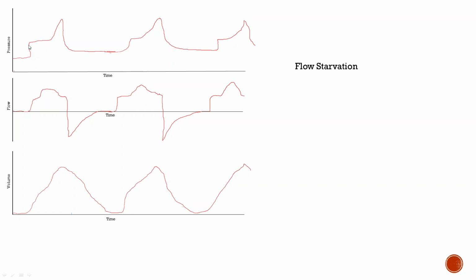So what you see here in the pressure cycle, what Gargi pointed out, it looks weird, looks like they're taking two breaths, is that actually they're sucking in here, so this is showing a more negative pressure than you're expecting. So you have this dipped out effect. And then on the flow, you can see the positive flow going in.